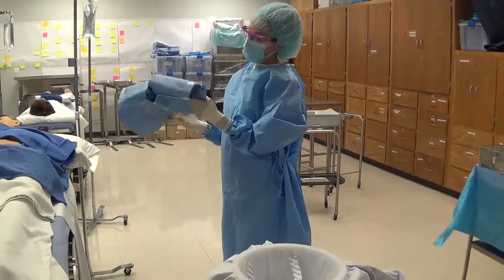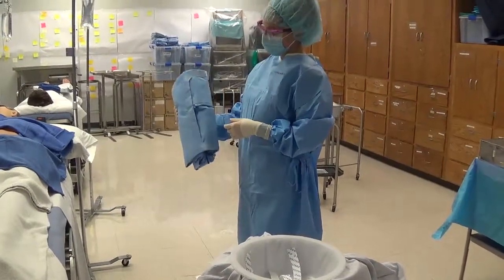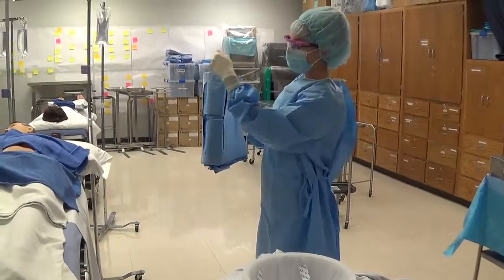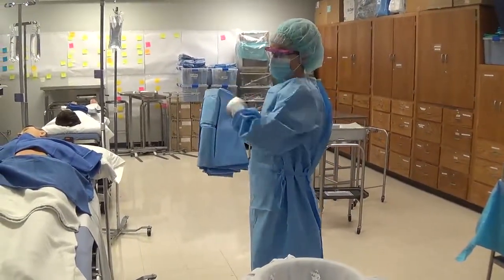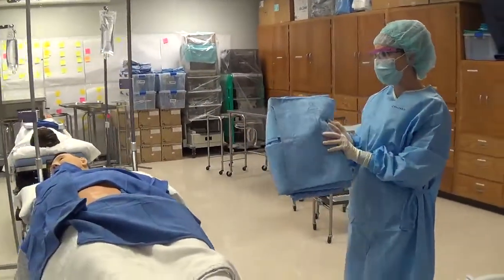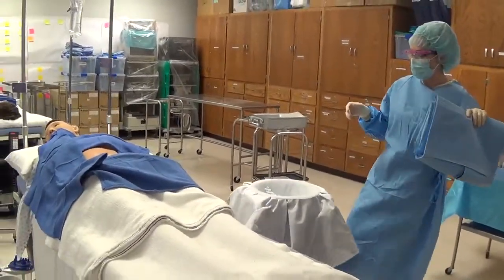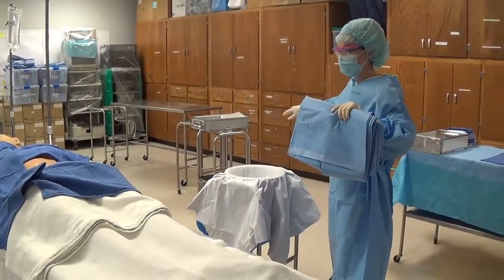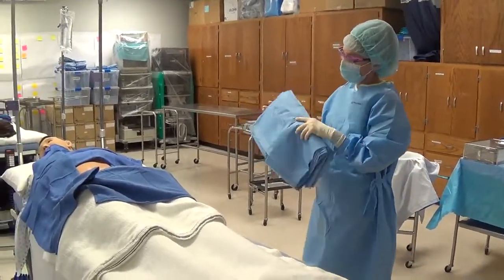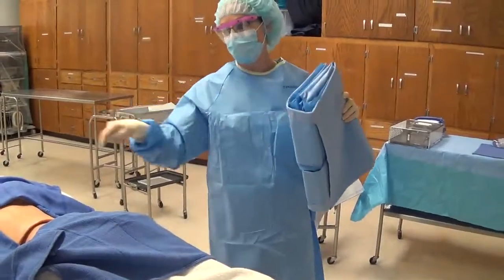Be very aware when taking stickies off — people tend to flop the drape around and get it close to their face. Hold it down here; don't bring it up by your face or bring the paper up by your face. Always pull away, never toward yourself or toward something unsterile. If you need to drop it on the ground to avoid contamination, sometimes that's necessary. Now we apply the drape with the fold down, fenestration around the square-off area, split it in half, and hand it to your surgeon — both watching the front of your gown near unsterile areas.